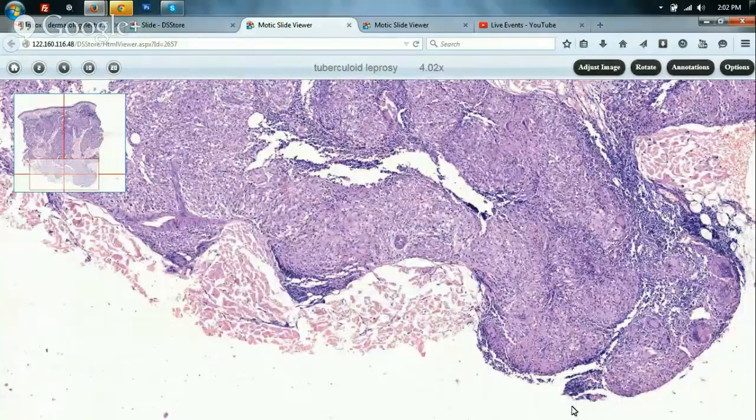After the paucibacillary form, we move to the other extreme — lepromatous leprosy — where bacilli are large in number. We'll have a glimpse of the type of granuloma seen in such conditions.